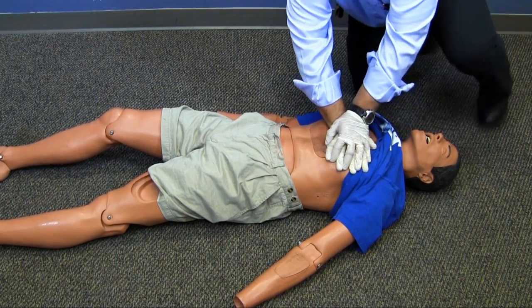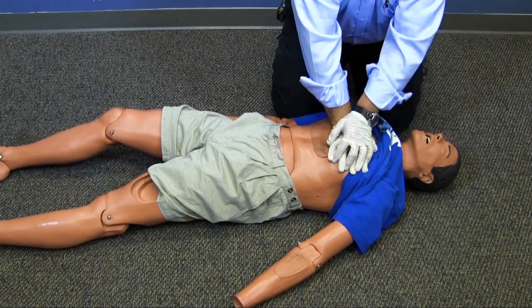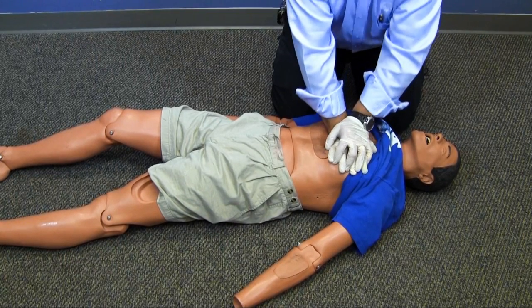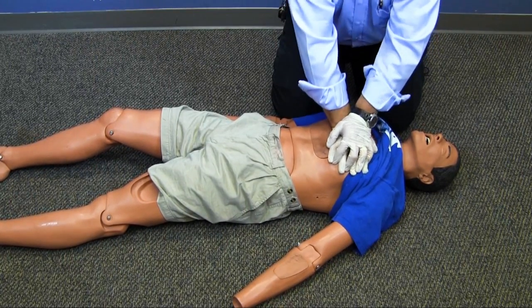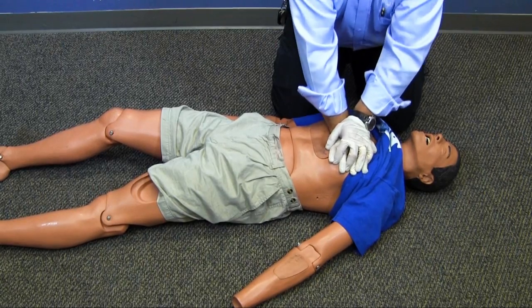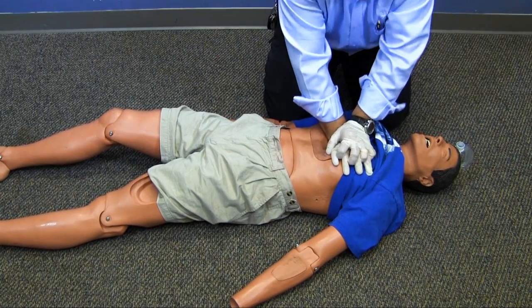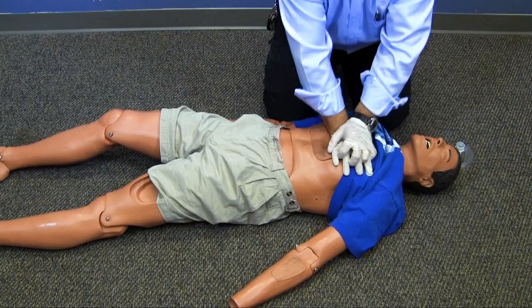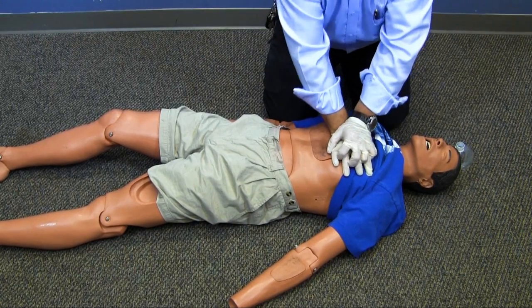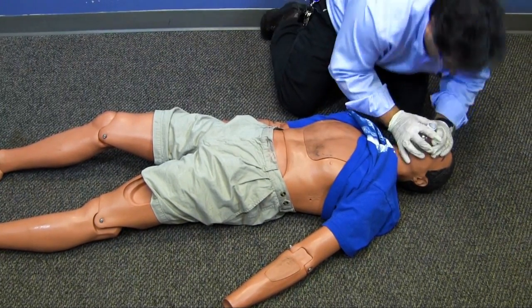While I am doing compressions, I want to get some additional EMS help — I or my partner will call for help. I will perform 2 minutes of quality CPR with adequate depth and rate, making sure I perform CPR with the proper compression to ventilation ratio and allow for the chest to recoil completely.